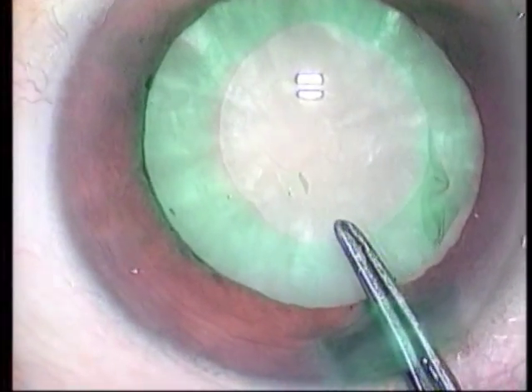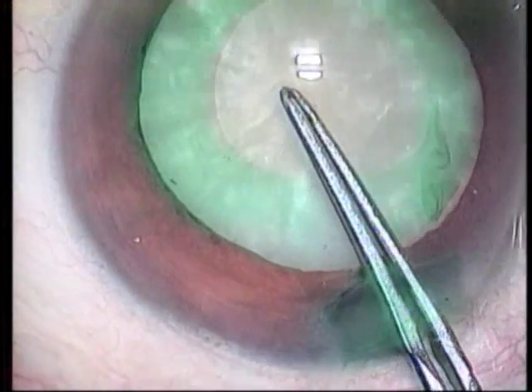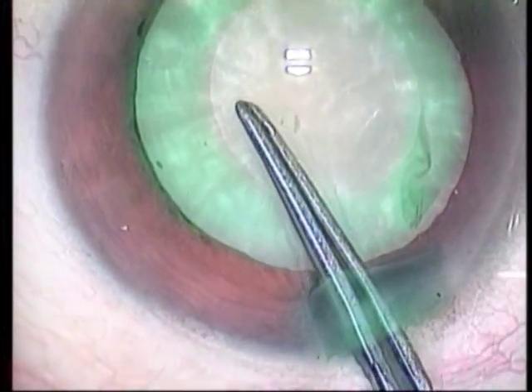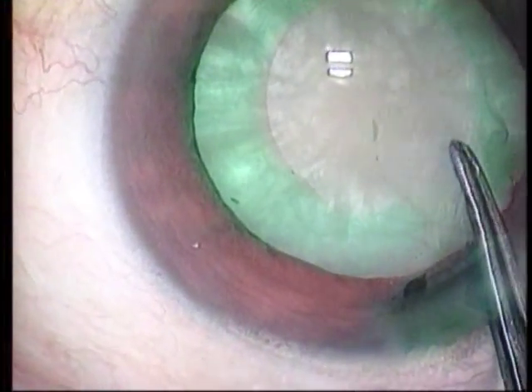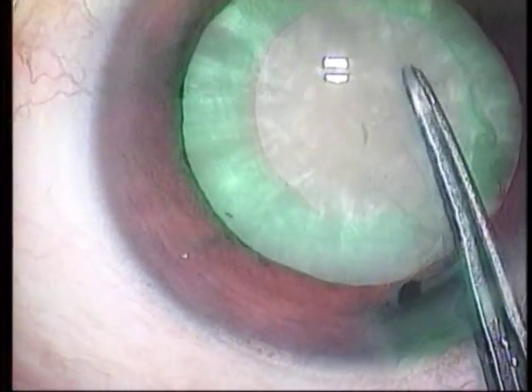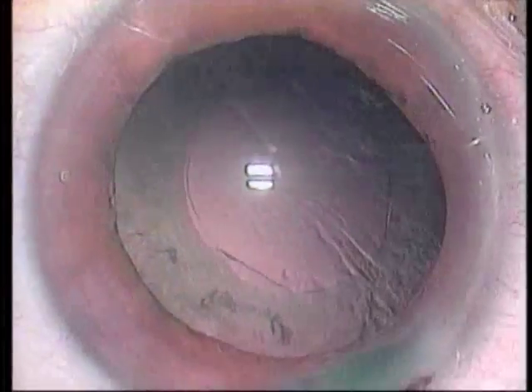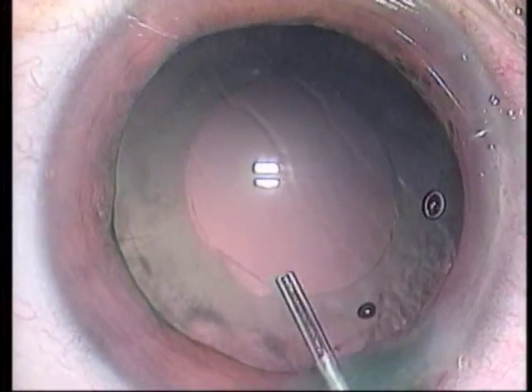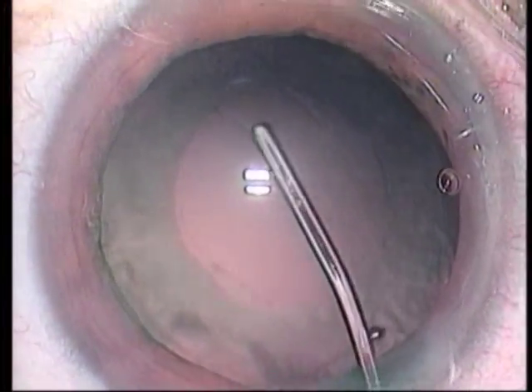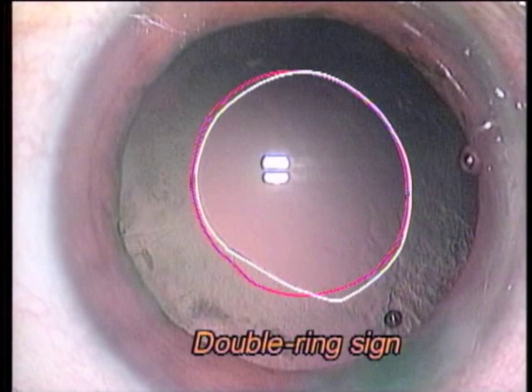Inamura's forceps is inserted again to puncture the second anterior capsule. A second CCC maneuver is performed starting at the center of the residual membrane. Since the capsule was not stained, identification is difficult. After nucleus and cortex removal, viscoelastic material is injected to inflate the capsular bag. You can see the two flat margins clearly — this is generally called a double ring sign.